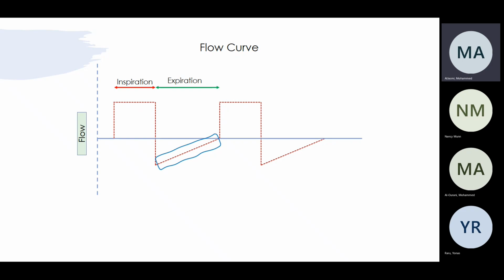So when we look at a flow, the main thing when it's volume control, I look at the expiratory part, okay? If it's not volume control, you should look at everything. But if it's volume control, the expiratory part, that's what I look at more. I look at if the patient is having obstruction, having auto PEEP, as you said, guys, or if the patient is trying to exhale before or after that, we put the time for them. Okay, so in here, that's the patient inhaled.